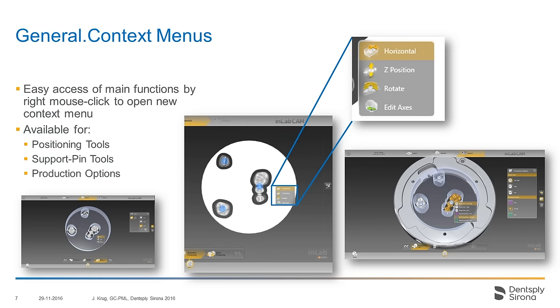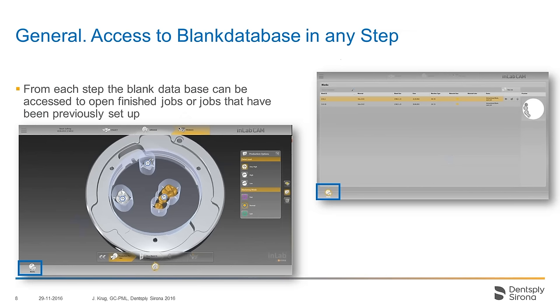The context menu will be available for tool positioning, pins of support pins, and production options. Also new in the software: no matter where you are, you will always be able to go back to your blank database here in the blue frame. This enables the user to open up a new job in the same application while another job is milling on one of the machines — you don't have to open the inLab software twice or three times; you just go back to the blank database and open up a new job without opening a new application.